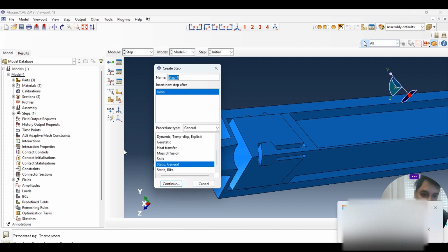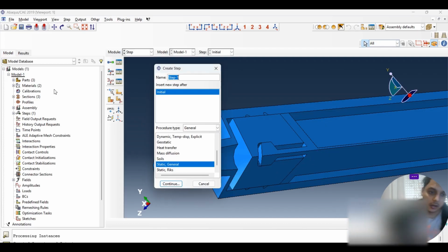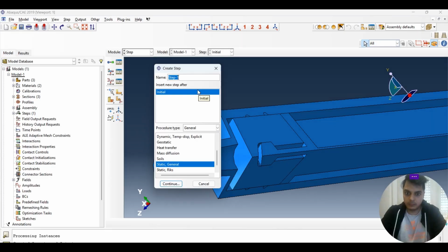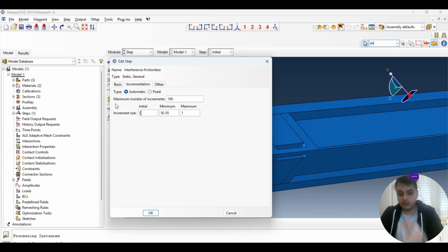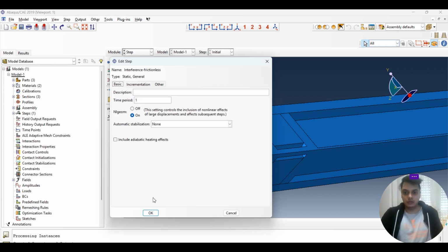So the first step that I want to define is related to the interference, the initial interference, frictionless, and that's a static general step. That's what we are dealing with. Make sure to apply nonlinear geometry when the material is given as nonlinear and we have higher strains. Incrementation is where we define how this particular step is going to run at particular increments. So it's good enough.